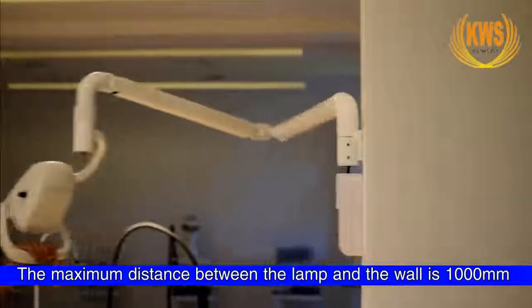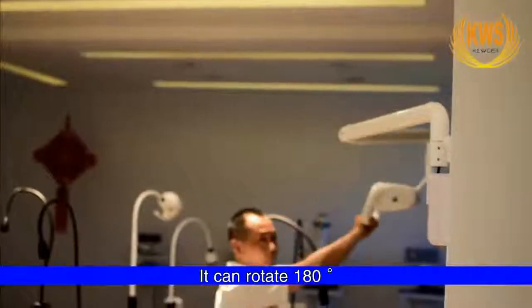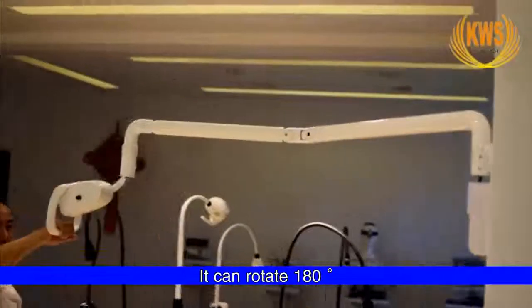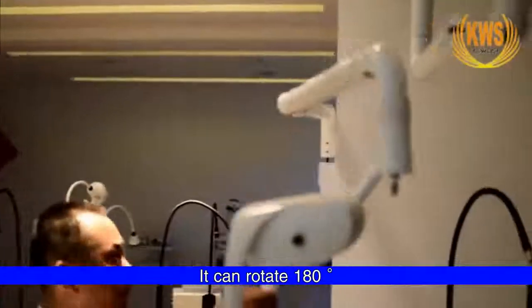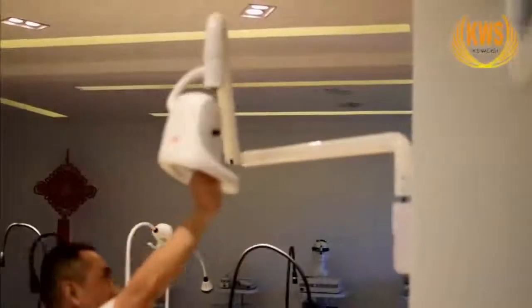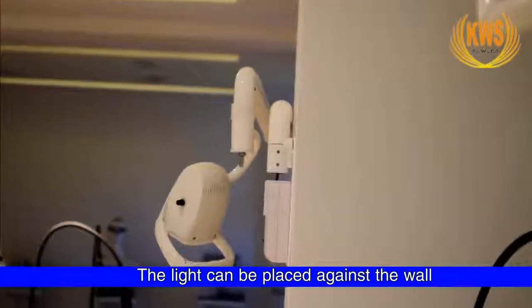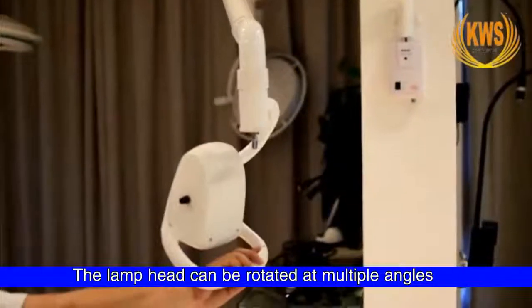The maximum distance between the lamp and the work surface is 1,000 mm, and it can rotate 180 degrees. The light can be placed against the wall, and the lamp head can be rotated at multiple angles.